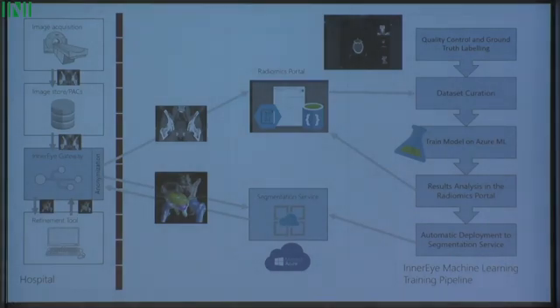What makes all these applications possible is the medical imaging workflow that we have developed over the past few years. This helps us build systems in a reliable and scalable manner. This is super important for a safety critical domain such as healthcare. There are two key parts to the workflow. One is the training pipeline, and the other one is the evaluation pipeline. All the stuff to the right happens in Microsoft or in the cloud, and the stuff to the left happens in the hospital. And this is how we collaborate with clinical partners as well.